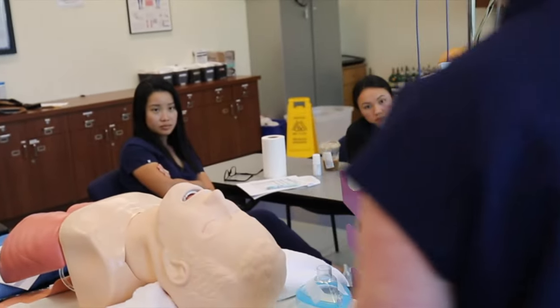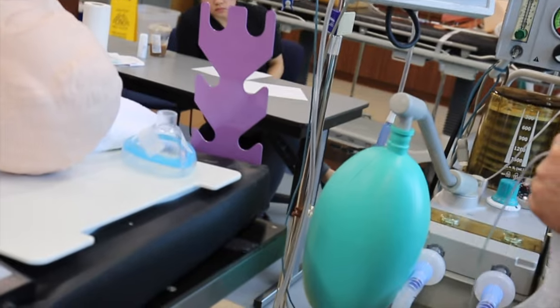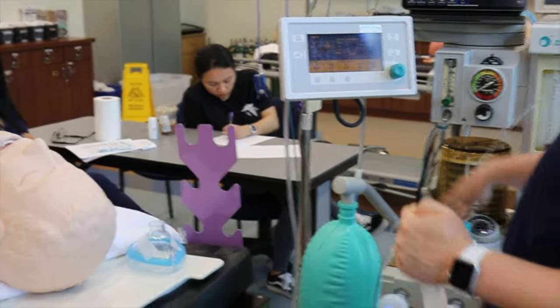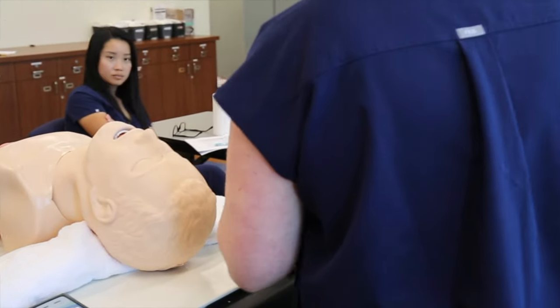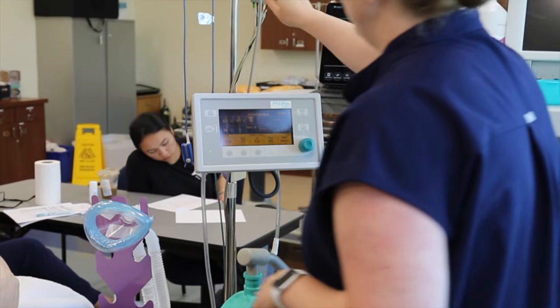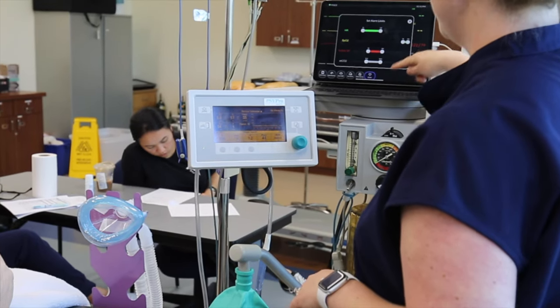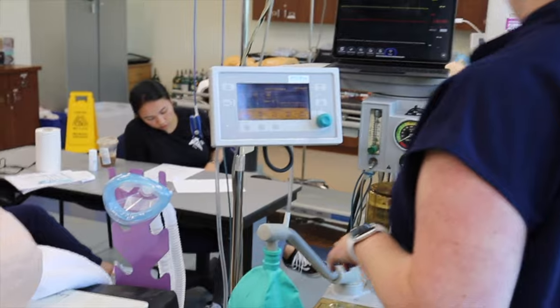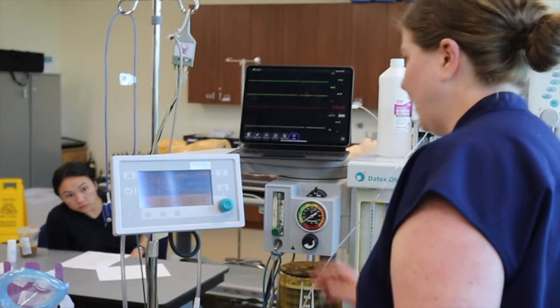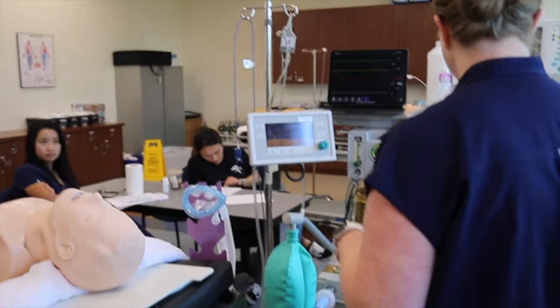And then I'm going to pressurize my circuit and make sure I can hold pressure. So, okay, and I'm holding for 10 seconds. That was 10 seconds. So that was my machine check, and then my monitors. I have my blood pressure, pulse ox, and EKG. I have the proper alarm settings on my monitor here. I have tape for my eyes on the mask, and then I have my ET tube tape. I have two IV poles, and when I saw my patient in pre-op, they had a working IV with IV fluids connected.